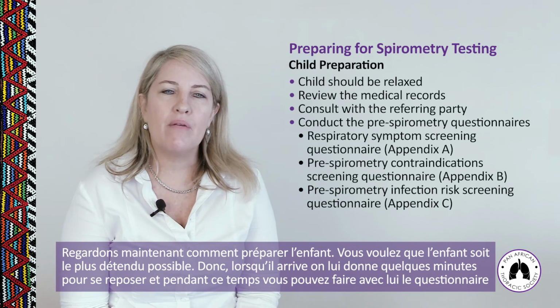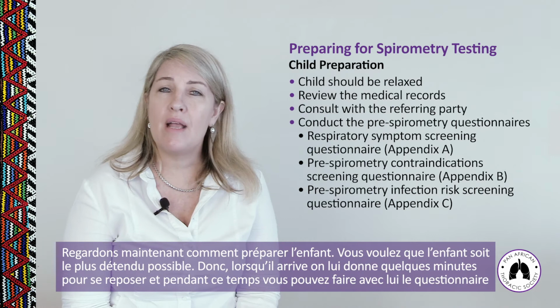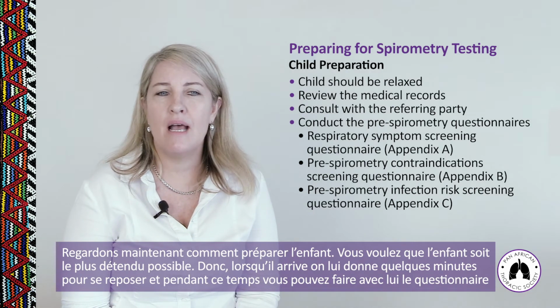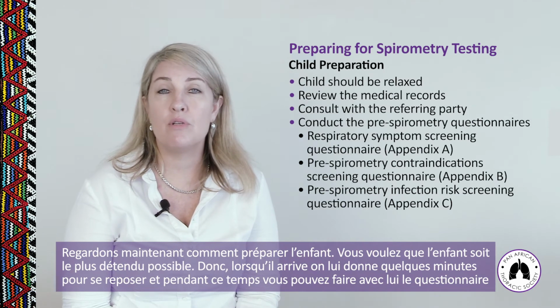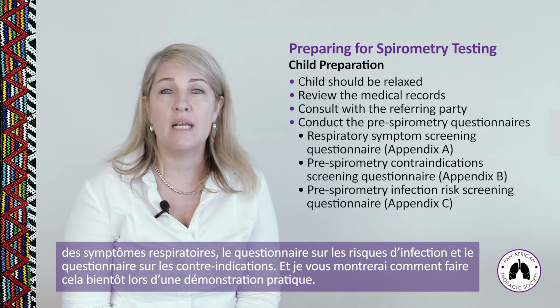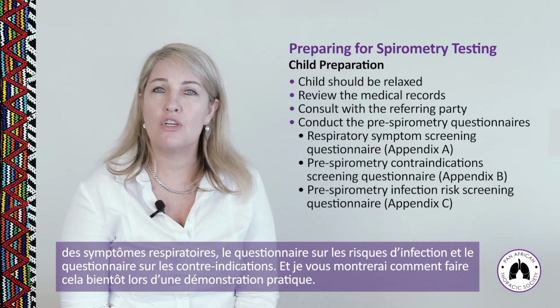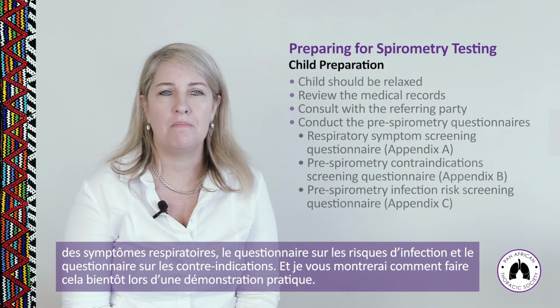So in terms of preparing the child then, you want the child as relaxed as possible. So when they come in, they have a few minutes to rest as they come in, and during that time, you can then conduct the respiratory symptom screening questionnaire, the infection control risk questionnaire, and the contraindications questionnaire. And I'm going to show you how to do that shortly in a practical demonstration.